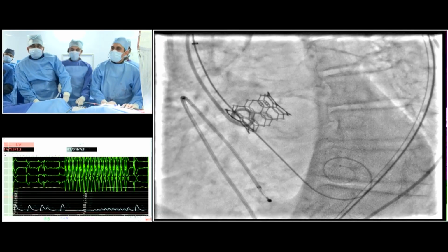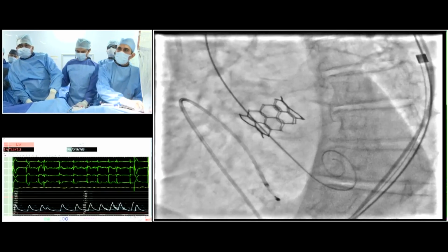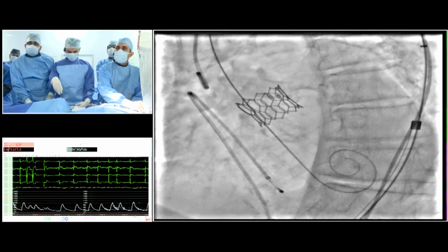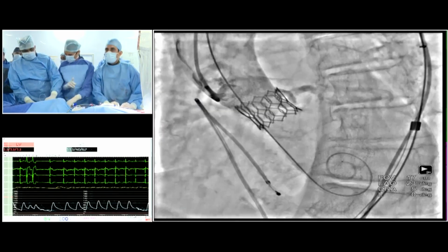I'm just more concerned about the coronary. Let's have a picture. And you can see the depth with the jailed pigtail. Okay, let's go ahead. Wait a minute. Show me the pigtail above. Okay. Ready for injection? Inject. Good. So coronary is flowing. Okay. Let's remove this thing.